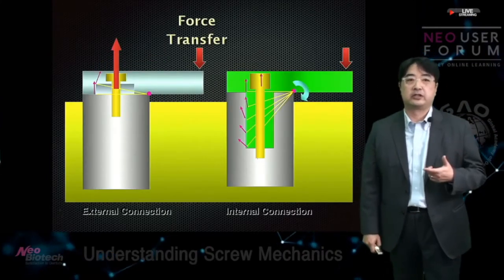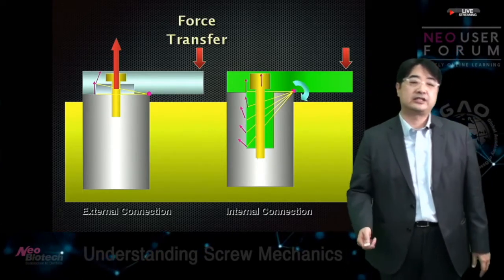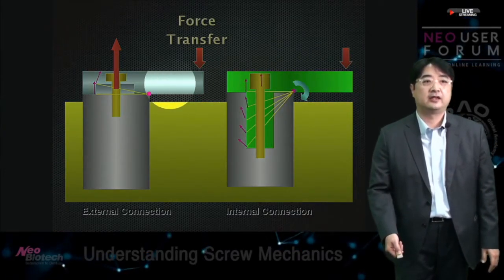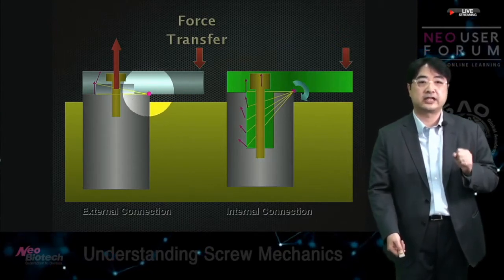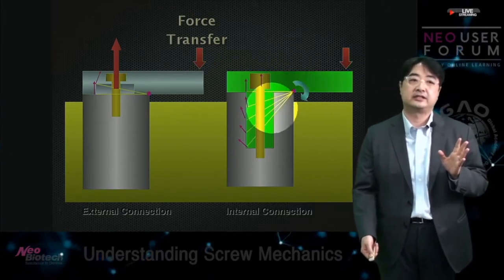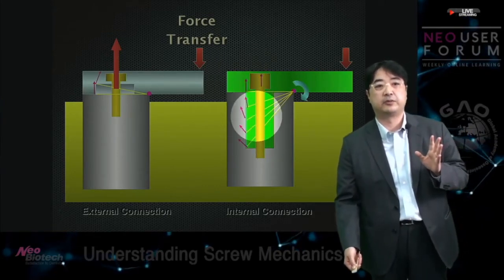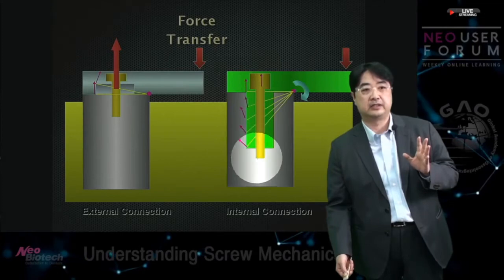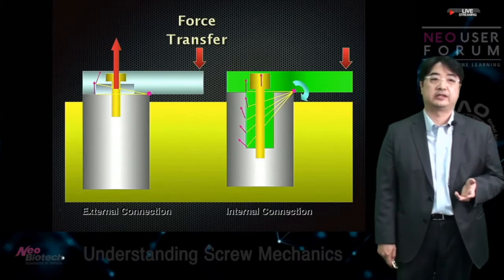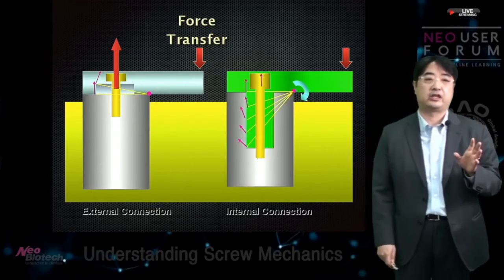Well, if you think about force transmission, the mechanics are different. In external, if you give the force right here, then this is a rotating point. This is the center of rotation, right? But in internal, against the force, it can be resisted from the internal area inside of the implant. So the internal connection implant resists the force more, right? So the two implants have different mechanics, and that's what we have to think about.